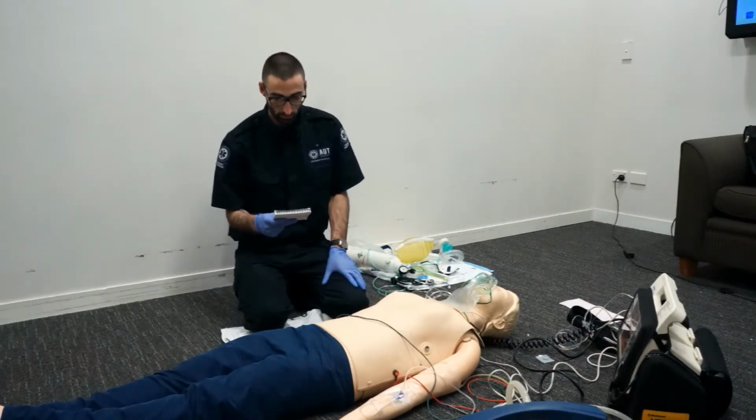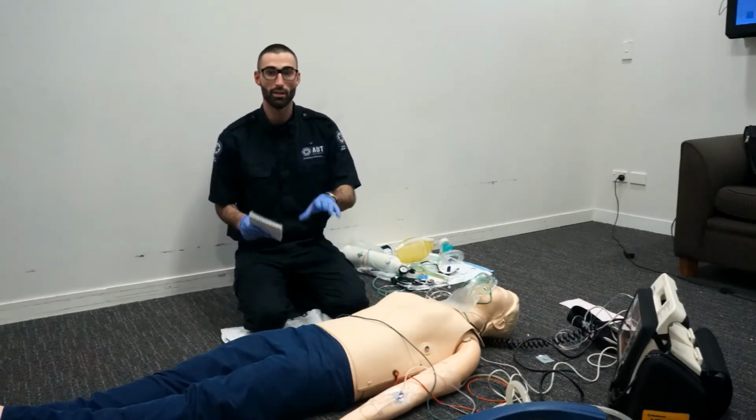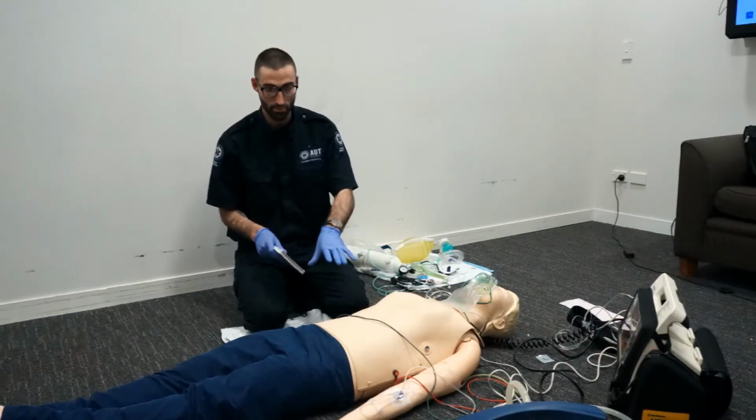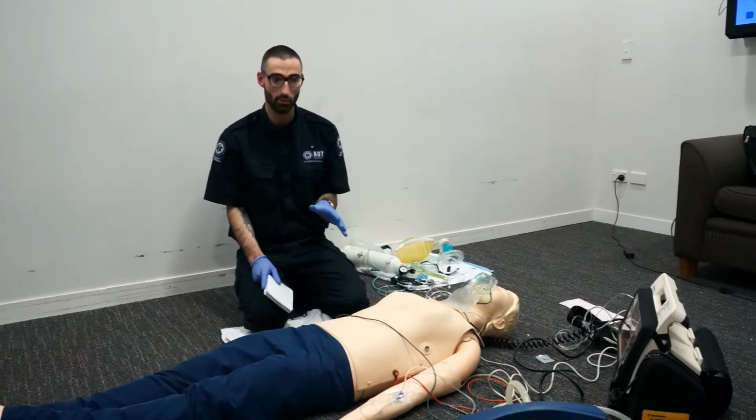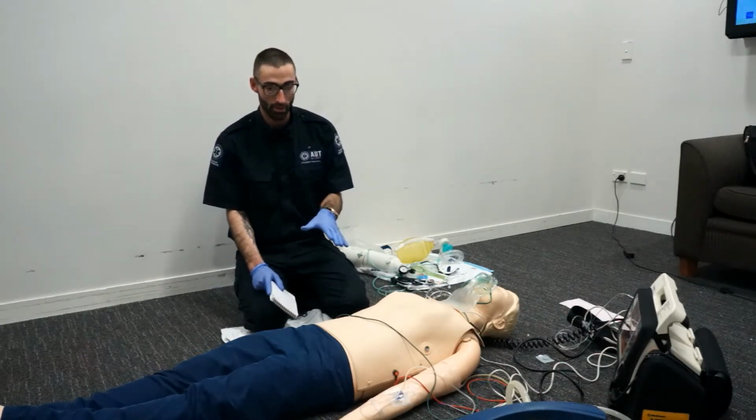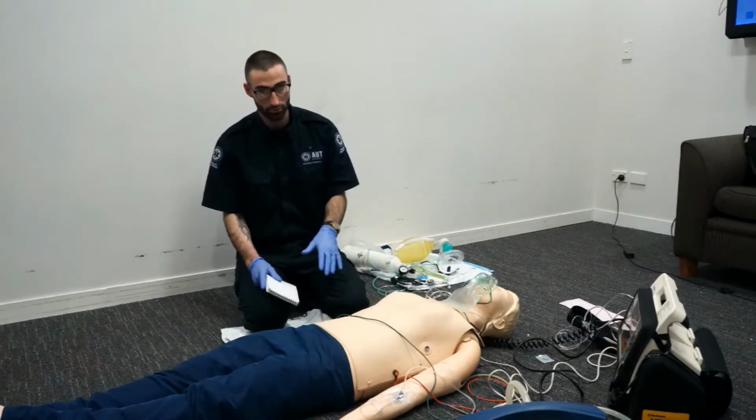Gain IV access, preferably in 2 sites. Okay, so we have bilateral IV lines placed here at a large bore. Prepare a running line of 0.9% sodium chloride. As we're treating severe TBI, we already have the sodium chloride running. That's elevated, allowing for unobstructed flow.